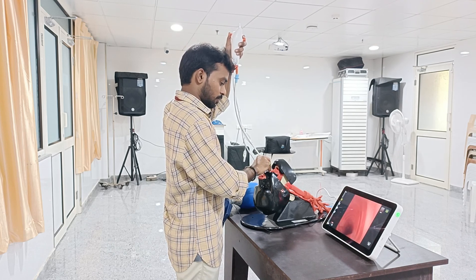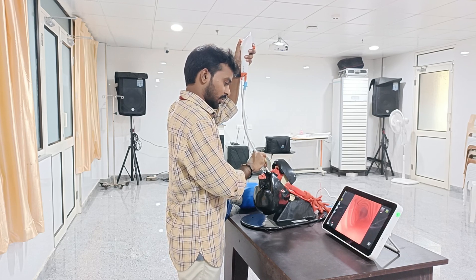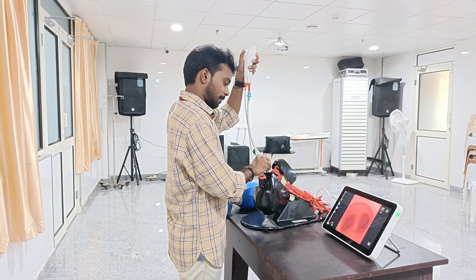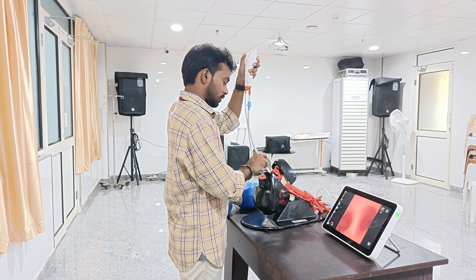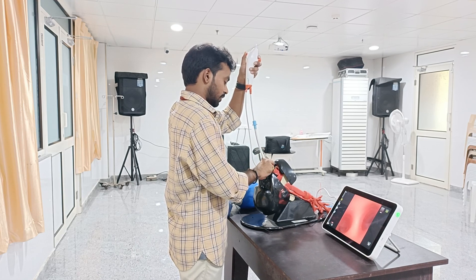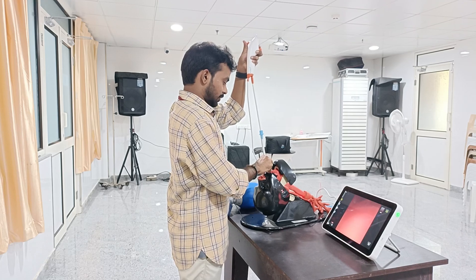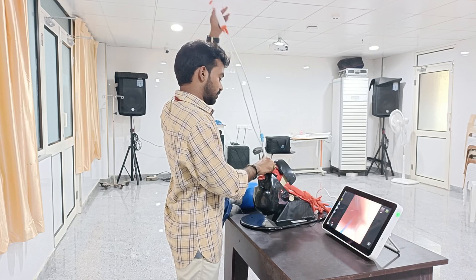Then we have to pass this tube slightly into the trachea — you can see the passage here. After going to a certain depth, that is up to the level of the carina, we can proceed. Then we have to insert this tube slowly, and after inserting this tube, we can take out the bronchoscope.